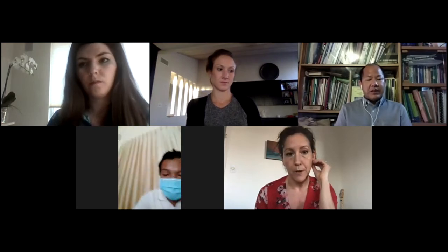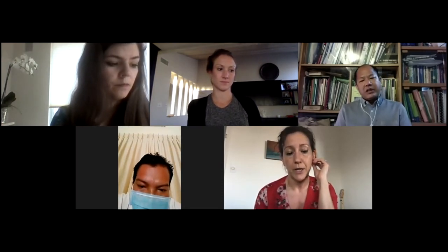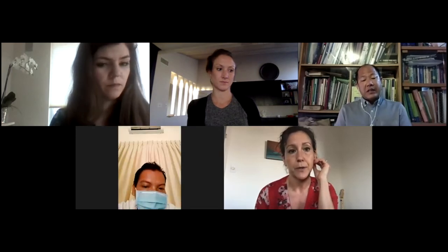I would just say that there are several questions about how much oxygen to deliver and which oxygen delivery device to select for patients. Much of that depends on the patient's requirements, and the patient's requirements are determined using a pulse oximeter as well as physical exam. If the patient is in respiratory distress, they may need more oxygen than someone who is breathing easily. But the best way to determine whether a patient needs oxygen is really to use a pulse oximeter.